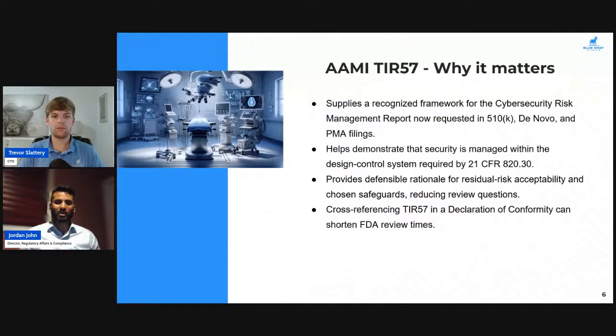So we're focusing on risk management, making sure we mitigate these cybersecurity risks as early as possible to avoid that costly downstream effect of waiting till the end. So ultimately, it needs to be right at the beginning. You don't want to wait till the end or the middle of the project. It would be too late. So start as early as possible, align it with your existing risk management process, and make sure everything works together and is harmonized.